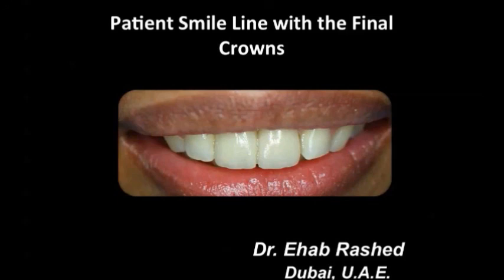So by implementing all these parameters that we discussed at the beginning, it shows us how we can use these very simple techniques, a very easy way. You don't have to be very well experienced, because as we all do implants, we all know how to do flaps, we do extractions such as wisdom teeth. You can go to that area just exactly as you do a wisdom tooth extraction. You can augment bone from that area. You can augment bone from anywhere in the mouth that you think has some extra bit of bone.